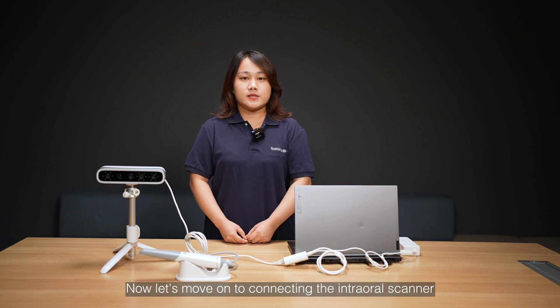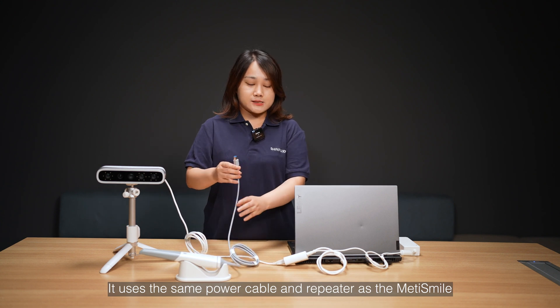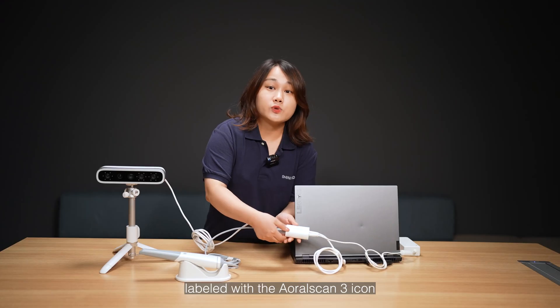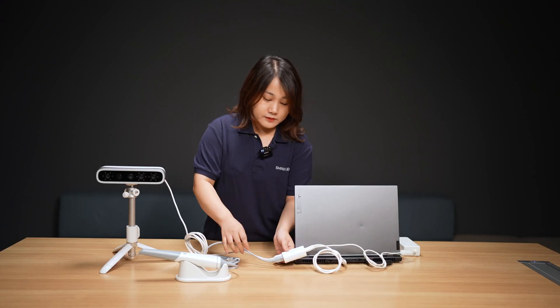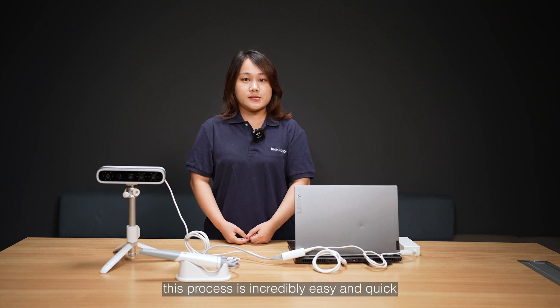Now, let's move on to connect the intraoral scanner, OroScan3. It uses the same power cable and repeater as the Matti Smile. Simply insert its cable into the port labeled with the OroScan3 icon. That's it. As you can see, this process is incredibly easy and quick.